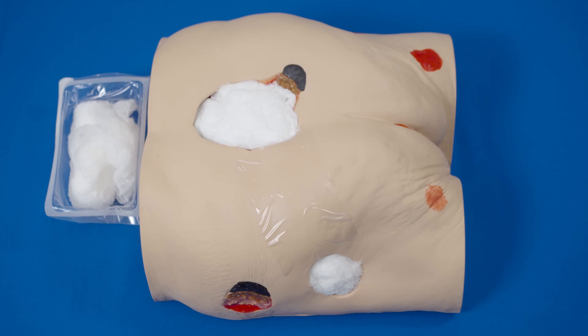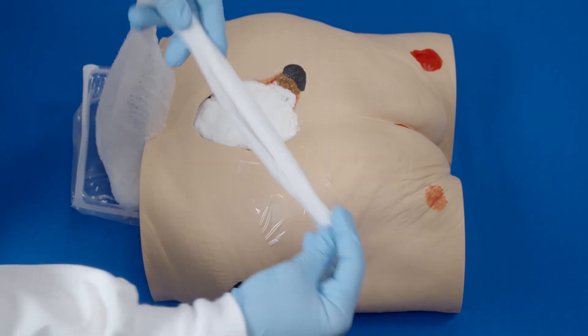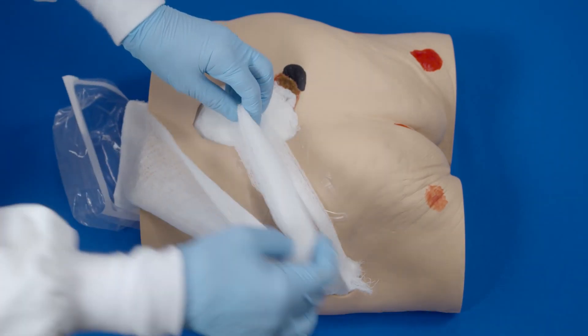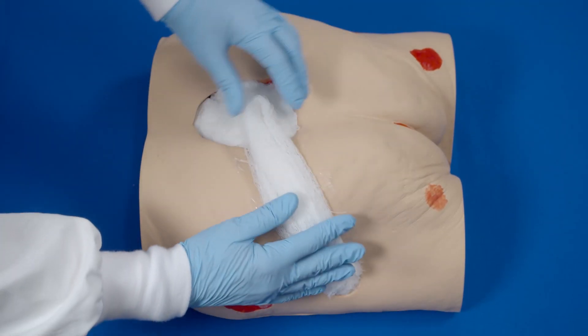Cut a gauze bridge three centimeters wide — that is about two pieces of gauze next to each other — long enough to connect the two wounds together, with a maximum length of 40 centimeters. Apply the bridge on the transparent film between the two wounds, ensuring it has good contact with the gauze in the wound and no contact with unprotected skin.